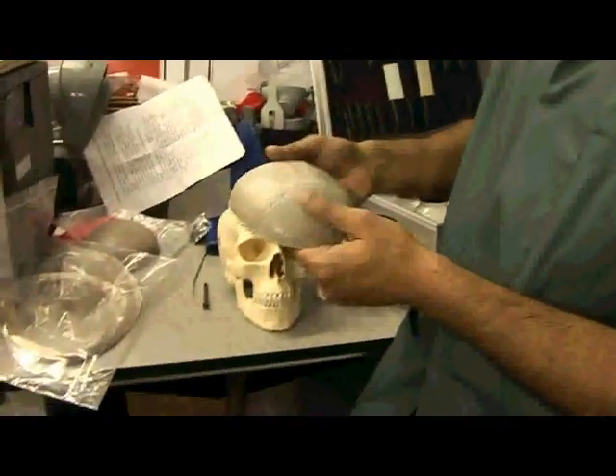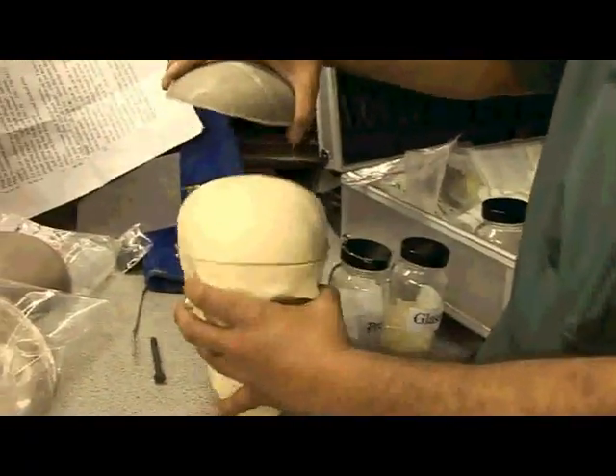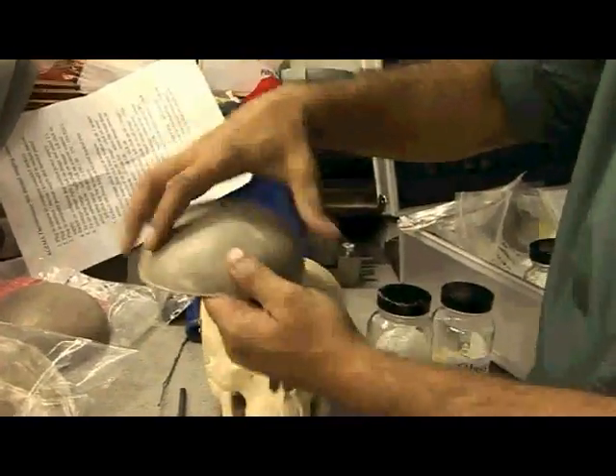And as you can see, this shell — this skull here — is very, very pliable, to the point where it's even picked up the contours of the skull defect itself.